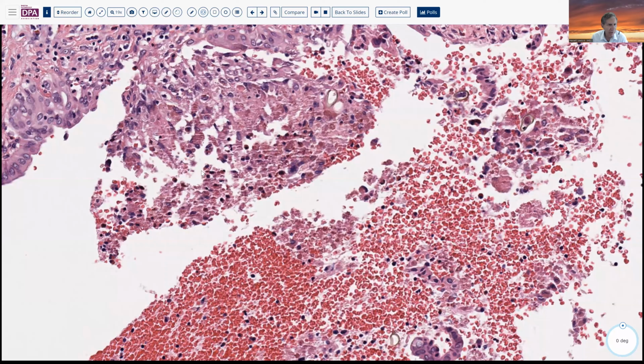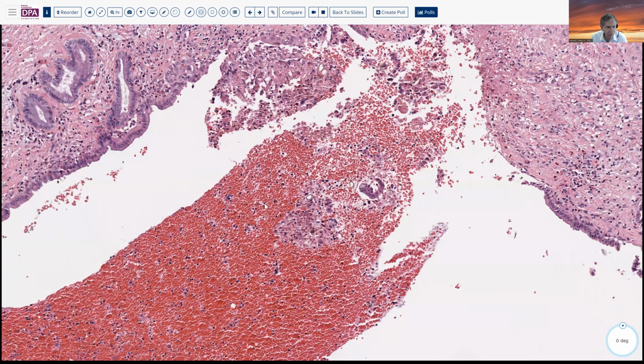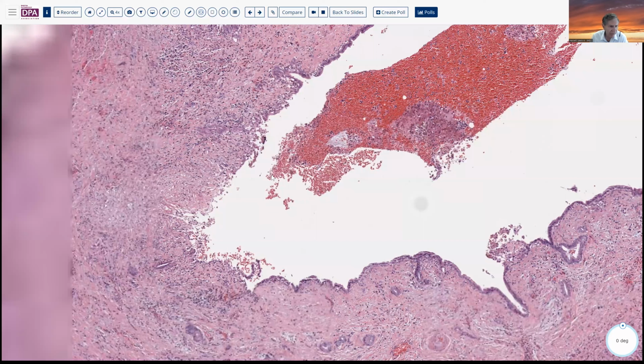and you may be beginning to wonder if this is a parasitic infection or some foreign body of some sort involving this liver. We can see here again this area of more fibroblastic proliferation surrounding this.